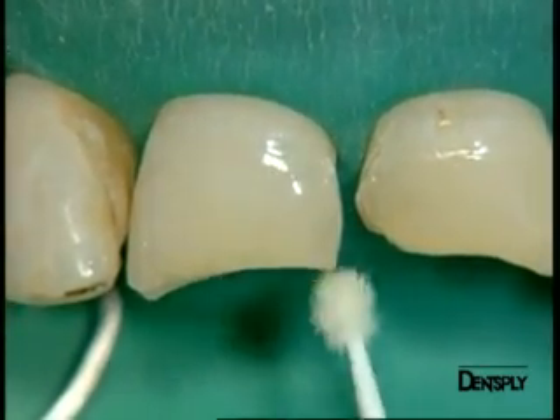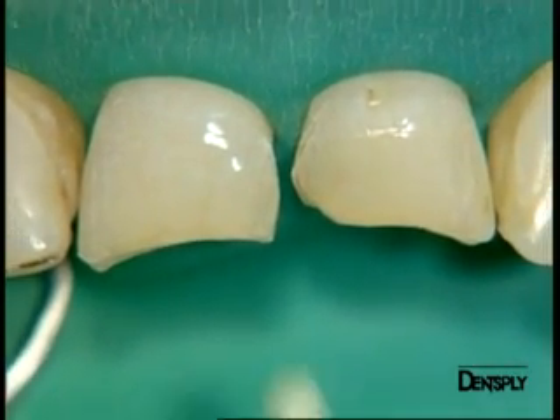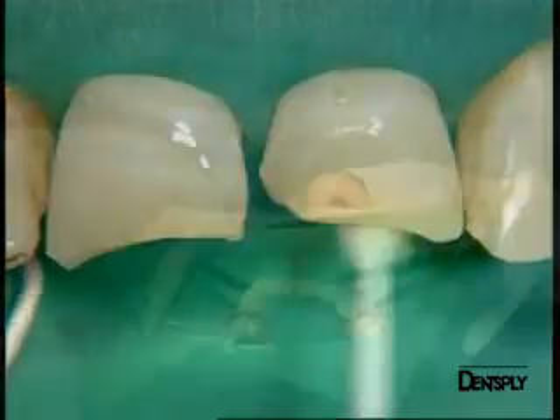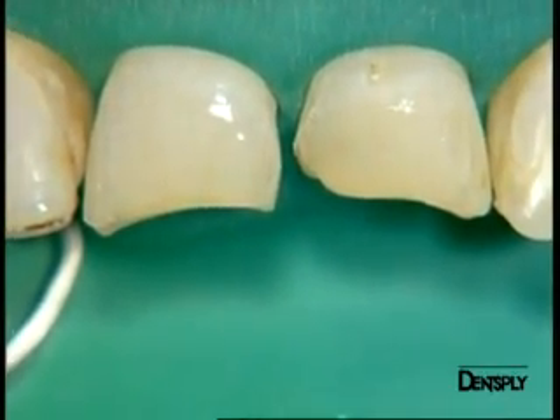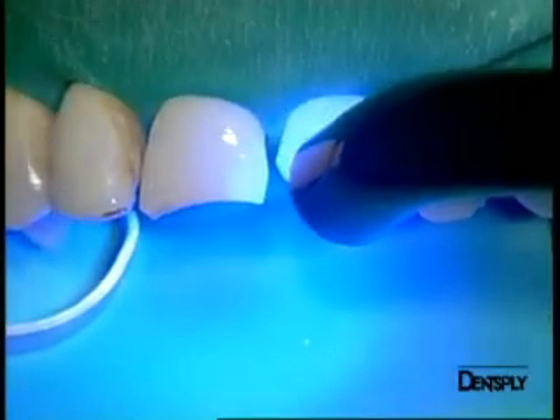This adhesive system contains nanoparticles ensuring superior marginal bond strength and protection against micro leakage. The viscoelastic properties of this adhesive system give better resistance in stress-bearing situations. This is particularly important for us as we will have to place large restorations.